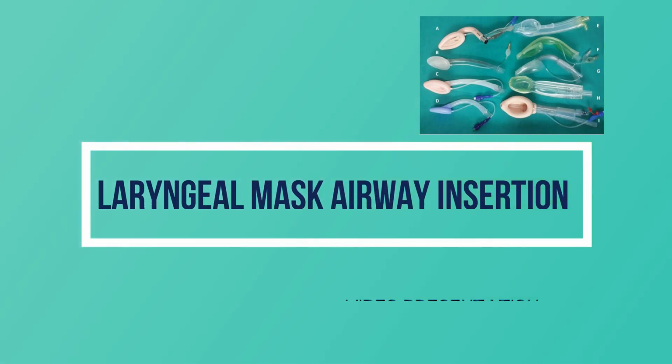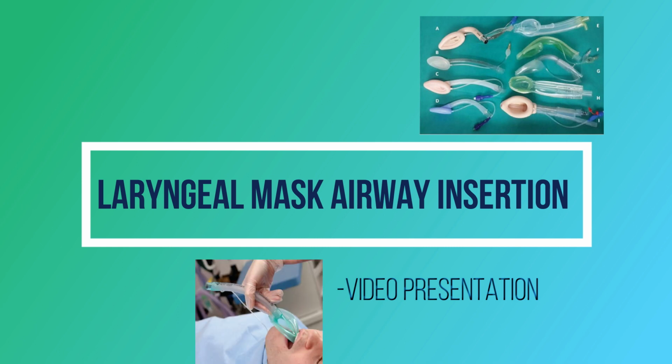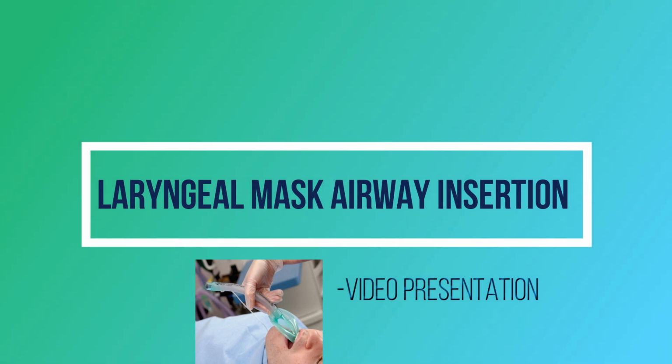Laryngeal mask airways are used to ventilate patients above the level of the vocal cords. They are an intermediate between a face mask and an endotracheal tube. The main advantages of these devices are that they are less invasive for the respiratory tract and better tolerated by patients, with increased ease of placement, improved hemodynamic stability, less chance of sore throat, and less coughing. They provide a hands-free airway and easier placement even by inexperienced personnel, along with a relatively secure airway.